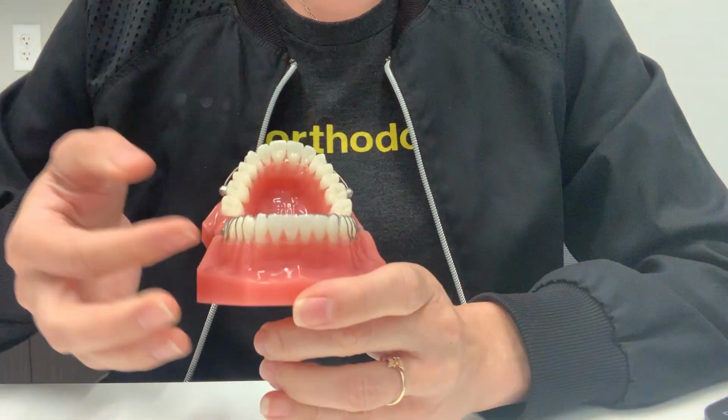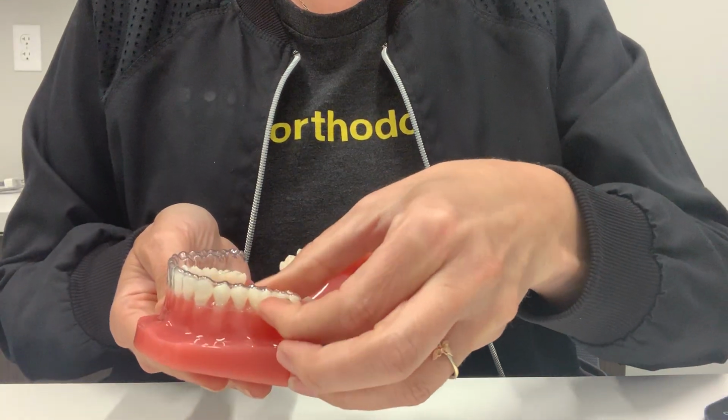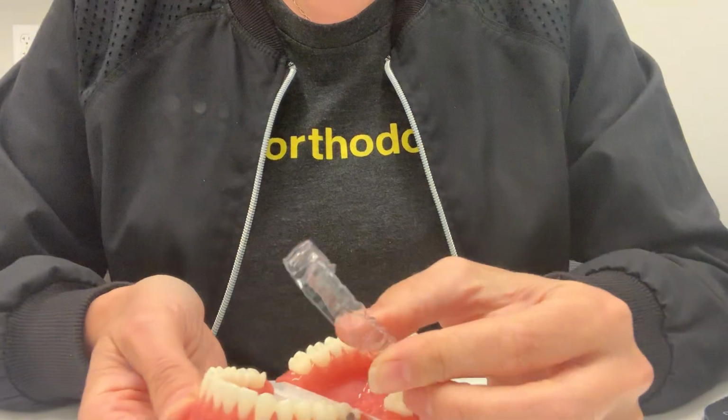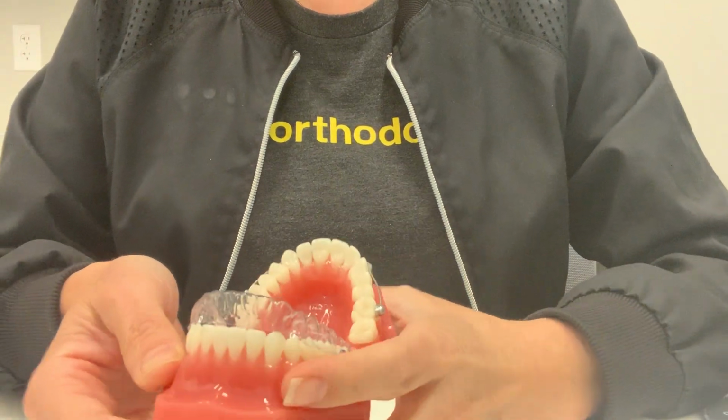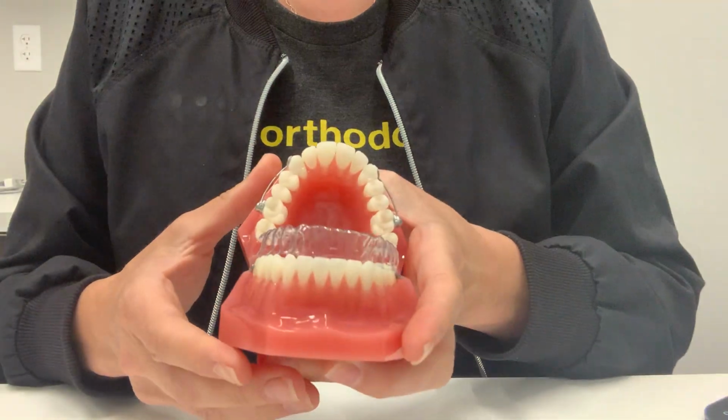To take it out, you're going to start in the back, lift up on one side, lift up on the other. If the retainer comes out, you're done. If the retainer still is in there, you're going to just inch your finger forward and lift up on each side again, one side at a time.